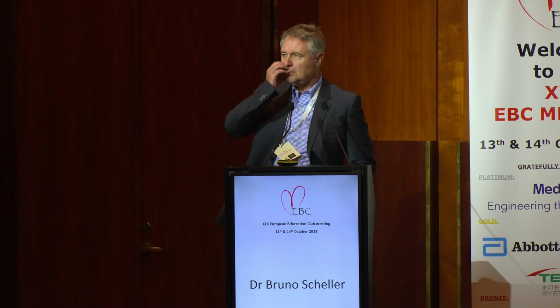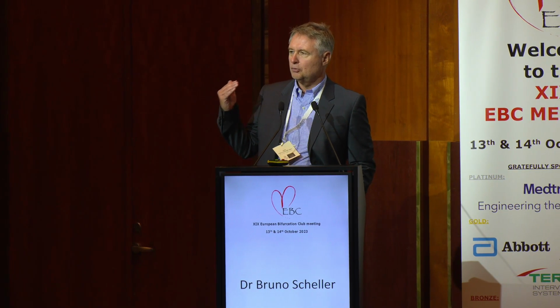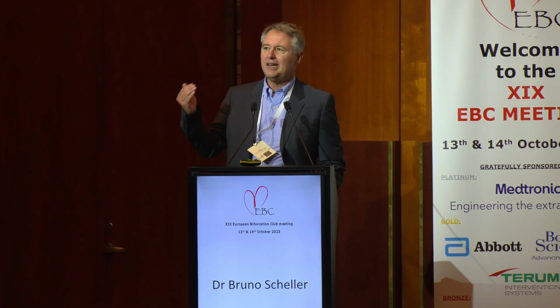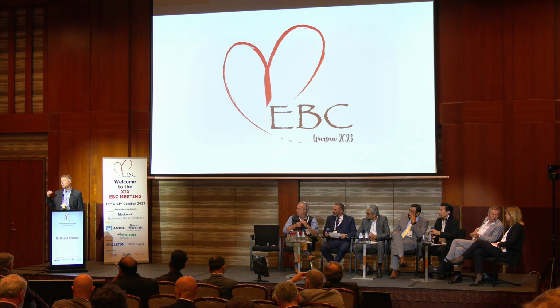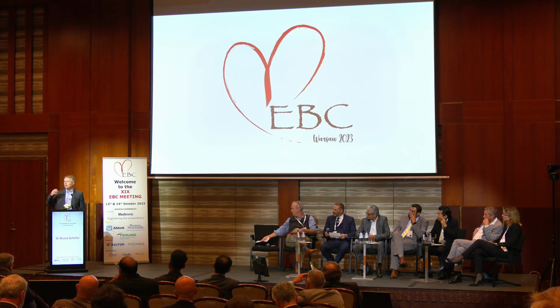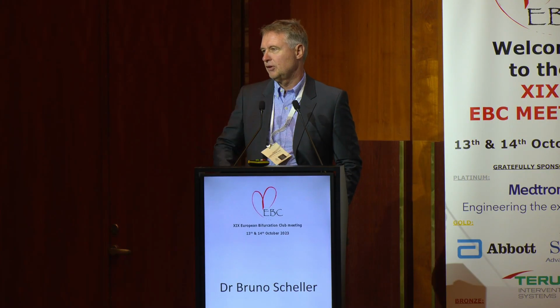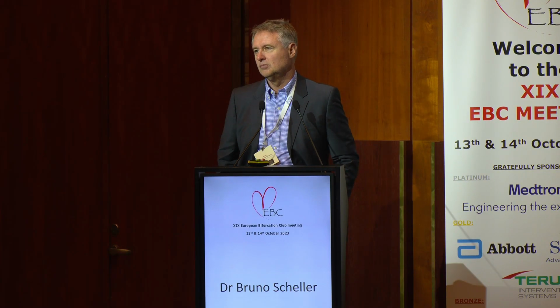I disagree a little bit. In my opinion, the issue of acute myocardial infarction is sometimes that you underestimate the real vessel size. And therefore, you sometimes implant too small stents. If you use a DCB, you can use the smaller size, but you do not have the issue that then there is no remodeling anymore possible if you have undersized your stent, for example.